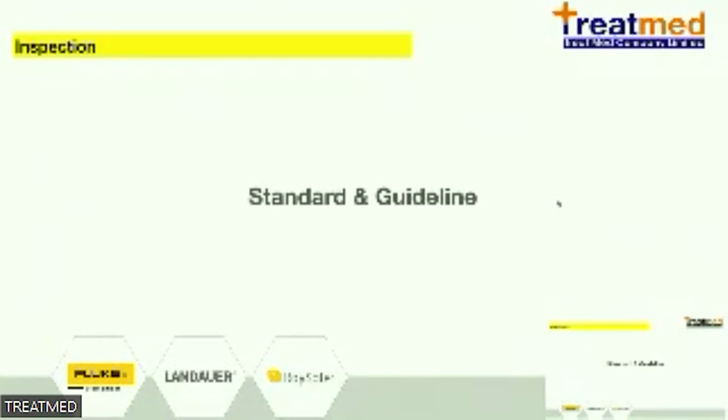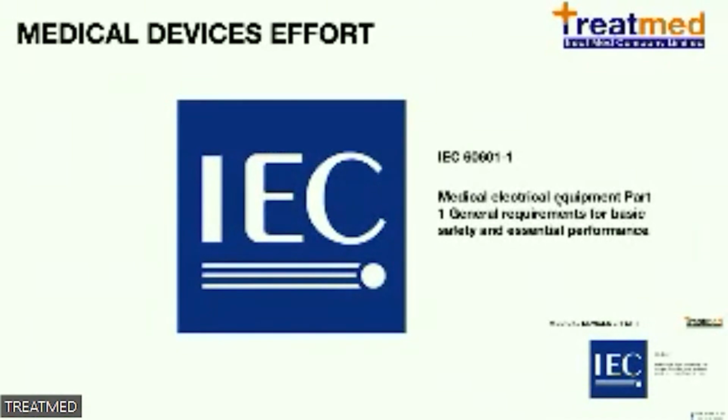Okay, the standards and guidelines in Thailand: almost all standards and guidelines in Thailand, we use the IEC. There are two IEC standards, and one guideline, which is the ECRI. For the IEC, we use two standards.